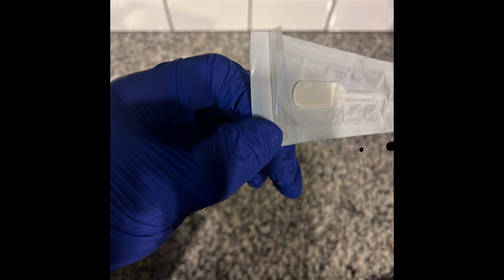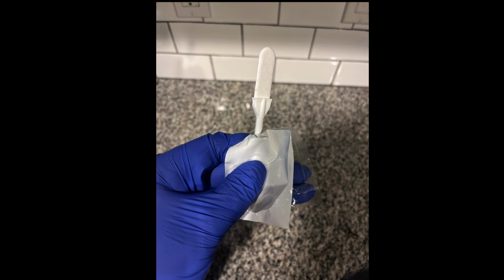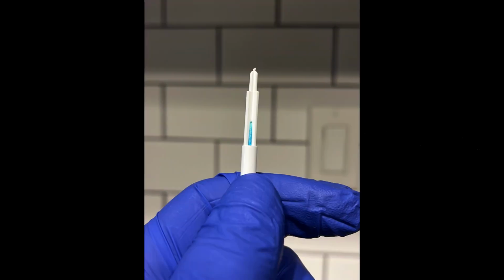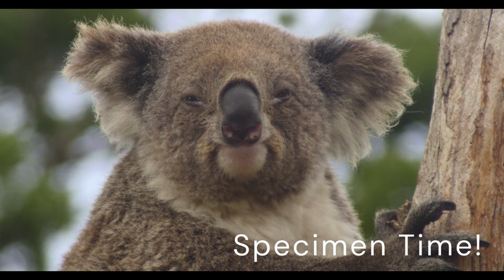When prepping your collection kit, you must remove the collector pad from its packaging. Just remember to be very careful and do not grab it by the pad itself. Grab it by the plastic end. And by the way folks, during your collection, keep an eye out for the little window towards the bottom of the handle. Once it turns blue, that'll let you know you have enough specimen on the applicator pad.